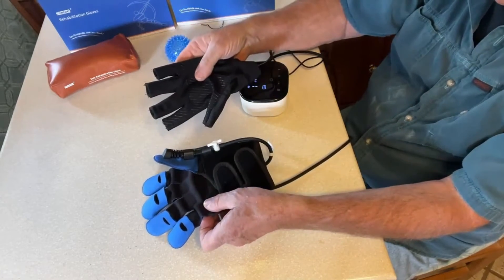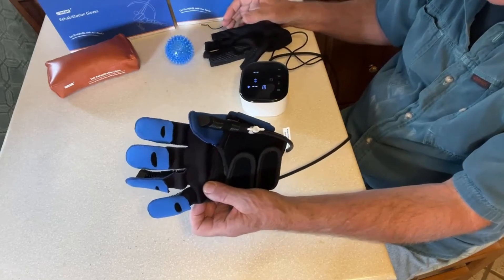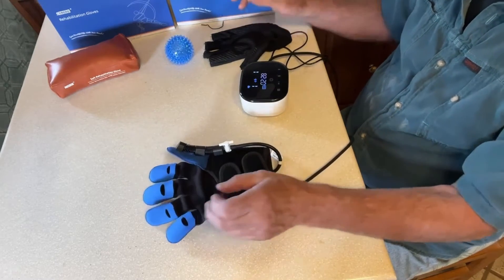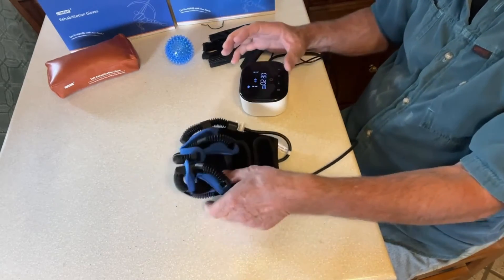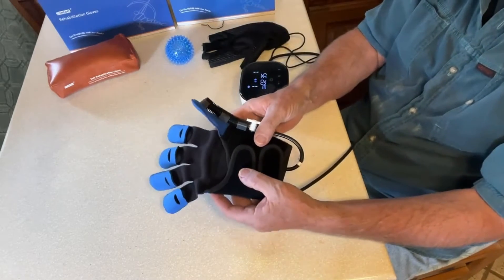The other mode is mirror training — you put this glove on your good hand, and whatever you do with your good hand is repeated by your debilitated hand. I'll turn it on so you can see what the glove is doing. This is the passive training mode — it's just opening and closing.